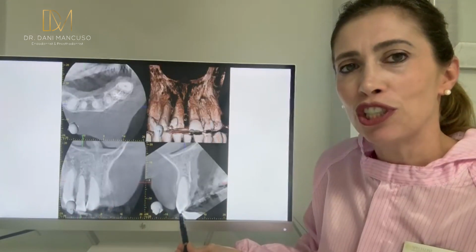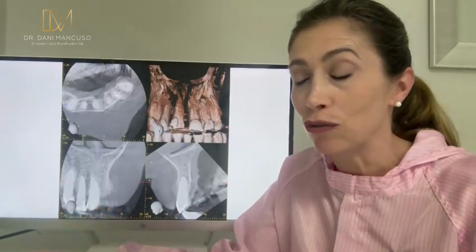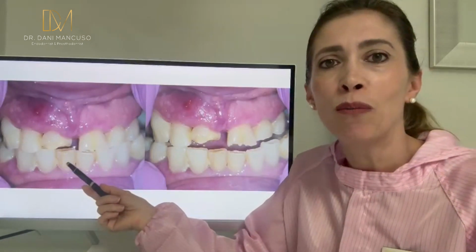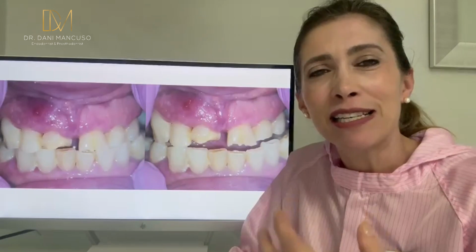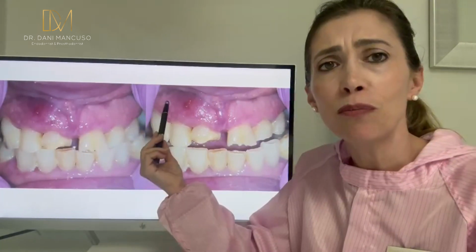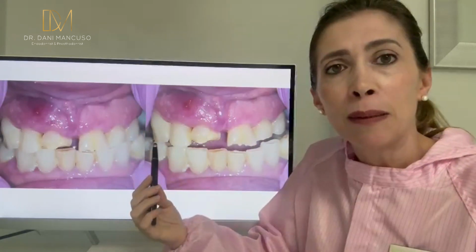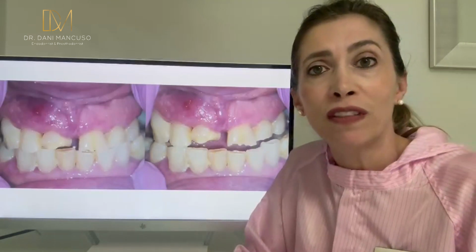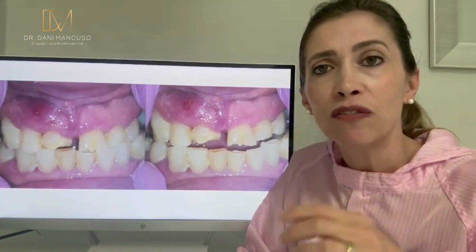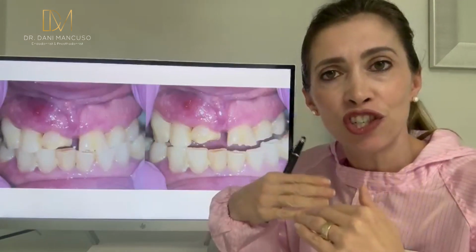And check the occlusion here. Well, of course, the CBCT is not for us to check the occlusion, but it's important to check the occlusion. In normal occlusion and protrusion, you can see that there is premature contact on that lateral. The lateral presents with a buccal fistula, and remember the mobility. The mobility is pretty much because of that premature contact. So it's important for you to bear that in mind, because after the treatment, you need to adjust the occlusion.